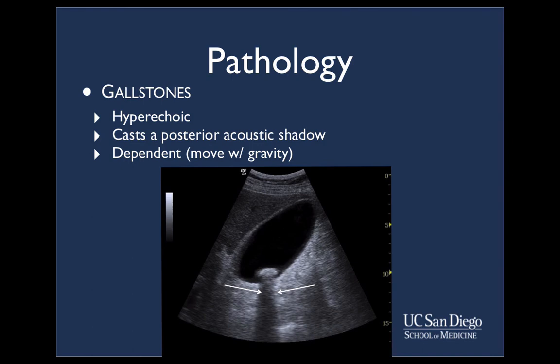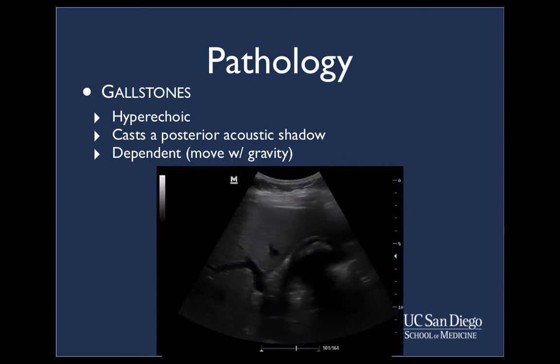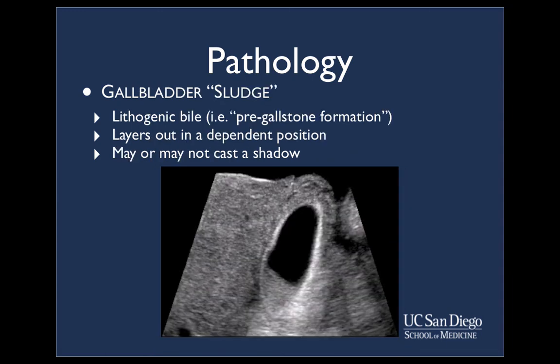Here is an example of a gallstone. Gallstones appear as hyperechoic structures within the gallbladder which cast a posterior acoustic shadow. In this video clip, a very large stone is present, occupying most of the gallbladder and casting a large shadow. Here is an example of lithogenic bile in the gallbladder — commonly referred to as gallbladder sludge — which has not fully formed into a gallstone and tends to layer out in a dependent fashion due to gravity. Sludge may or may not cast a shadow; however, sludge, similar to gallstones, can still result in biliary tree blockage or cholecystitis.